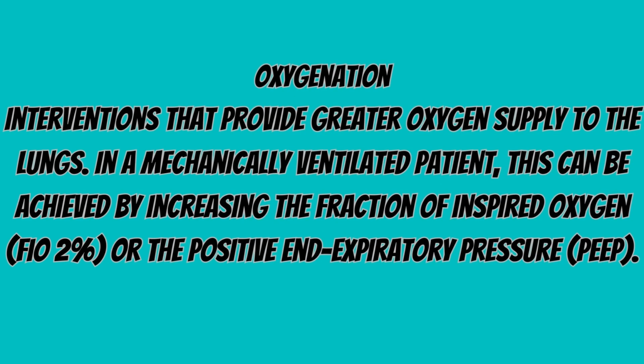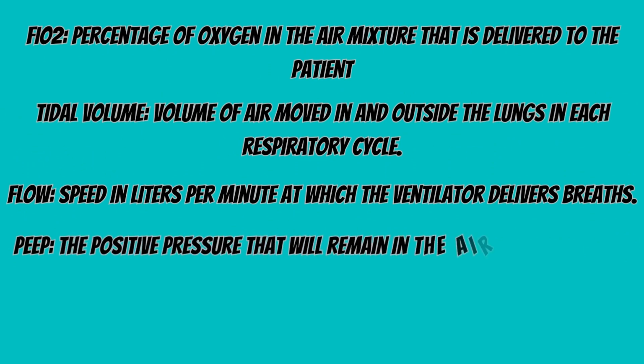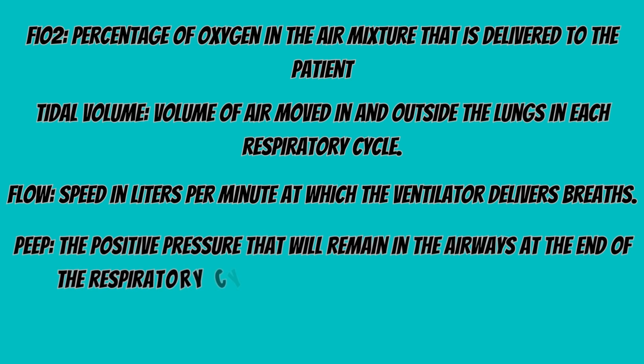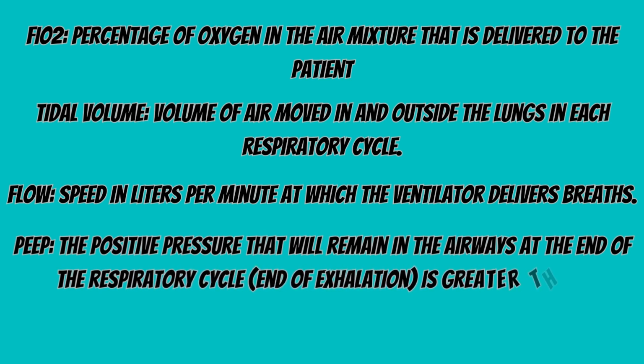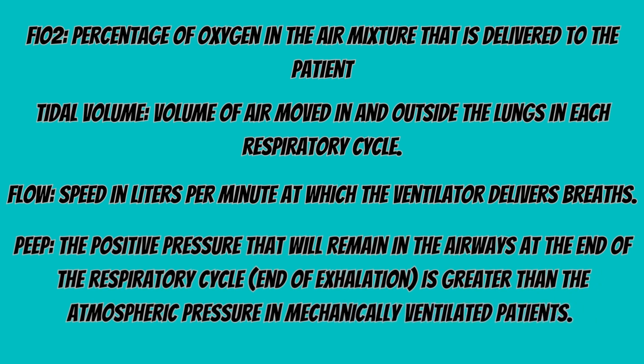Oxygenation: interventions that provide greater oxygen supply to the lungs. In a mechanically ventilated patient, this can be achieved by increasing the fraction of inspired oxygen, that is FiO2%, or the positive end expiratory pressure, that is PEEP. FiO2: percentage of oxygen in the air mixture that is delivered to the patient. Tidal volume: volume of air moved in and outside the lungs in each respiratory cycle. Flow: speed in liters per minute at which the ventilator delivers breaths.